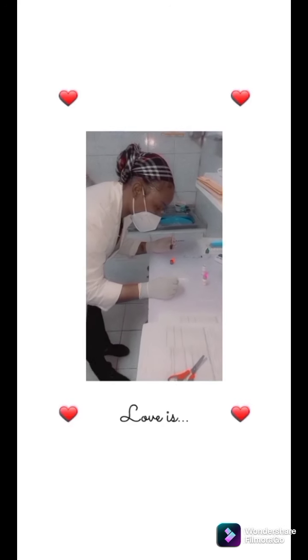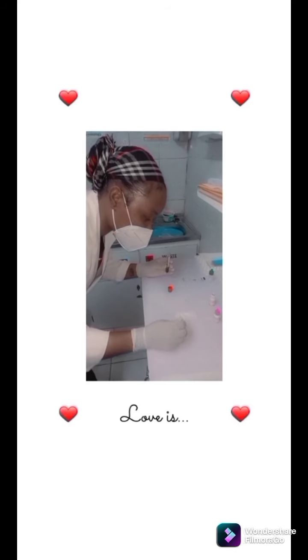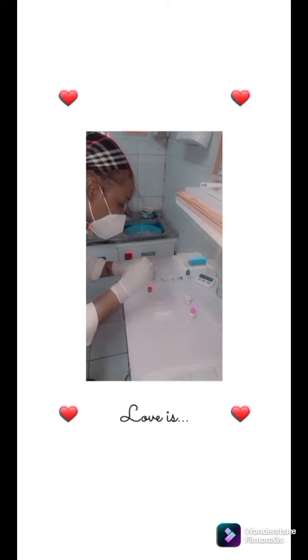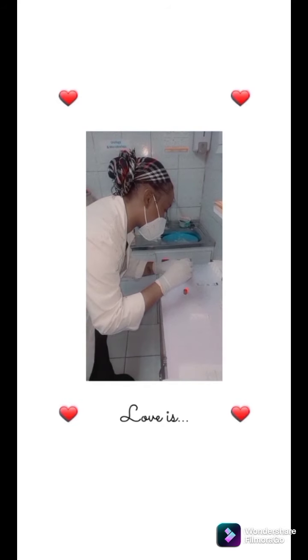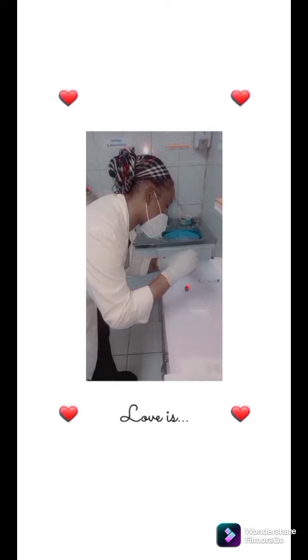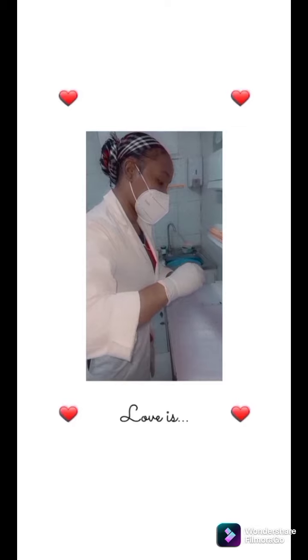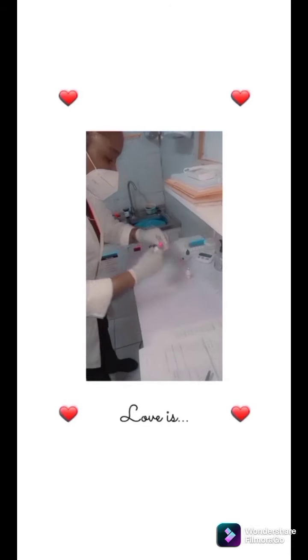Now we'll have a look at skin puncture, also known as dermal puncture or capillary puncture. This is a blood sample collected from a puncture on the finger, the heel, or an earlobe. It is less invasive, requires a small amount of blood volume, and can be performed quickly and easily. This technique has become more popular with the widespread use of point-of-care testing. Skin puncture instead of venipuncture can be especially important in pediatric patients to avoid blood reduction and the risk of anemia. It is also recommended for adult patients with severe burns, those who are obese or older, those with fragile veins, and those who self-test their blood, such as for glucose testing.